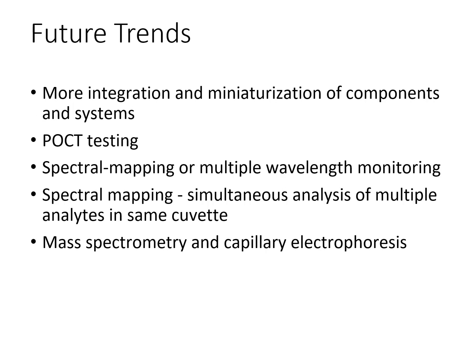Some future trends we've got going on. So more integration and miniaturization. Ongoing efforts have been going on to make laboratory components and systems smaller and more integrated for enhanced efficiency and portability. So that falls directly in line with point of care testing. There's been an increased emphasis on rapid testing near the patient. It helps to reduce turnaround times and it helps to improve clinical decision making.